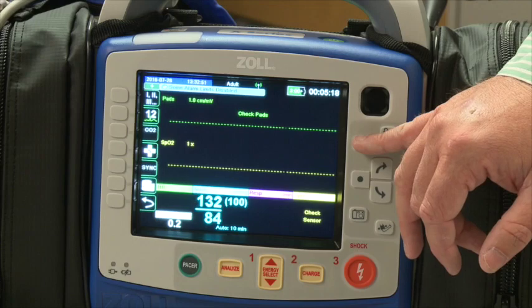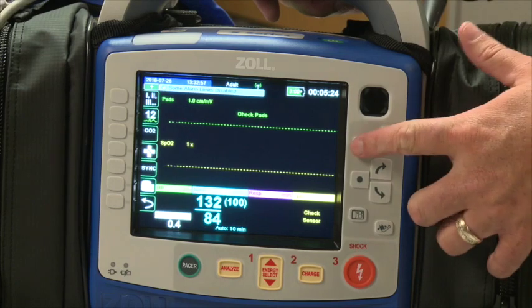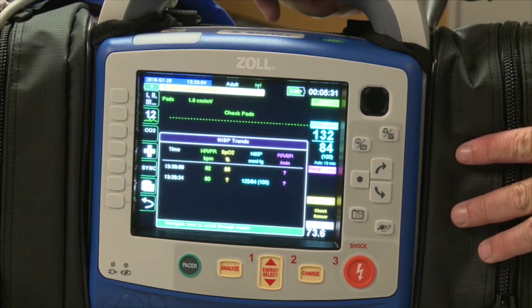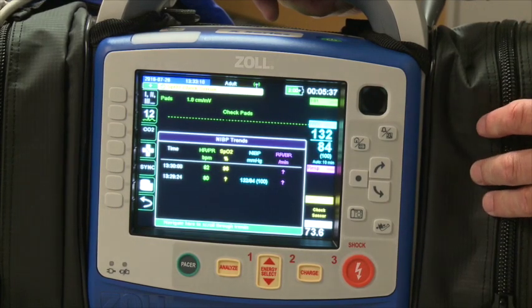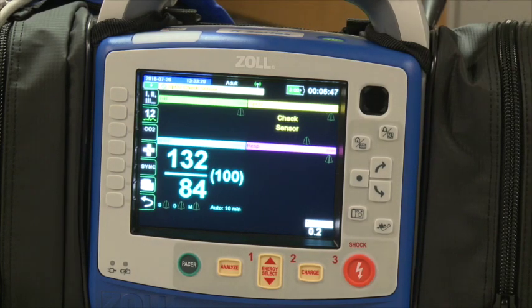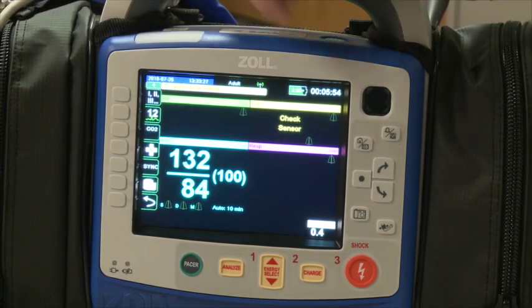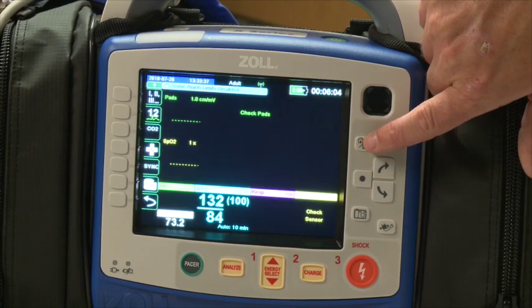The second key down — the home key — does four different things and you'll use it quite a bit. First, it scrolls through three different screen views. The home screen is the default when the device turns on. Press the home key once and it goes to a trend screen, which shows numeric values on a five-minute interval — SpO2 trending, end-tidal CO2 trending, blood pressures, etc. Press it again for large numbers — a kind of BLS screen with no ECG tracing but showing heart rate, SpO2, carbon monoxide, last blood pressure with time, respiration rate, and end-tidal CO2. Press it a third time to return to the home screen.